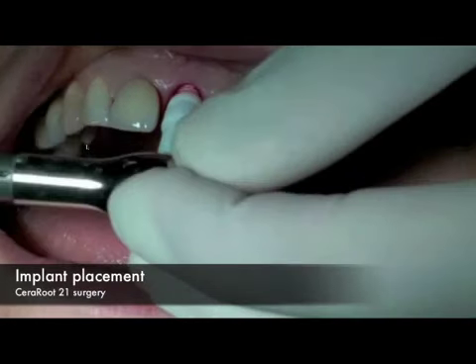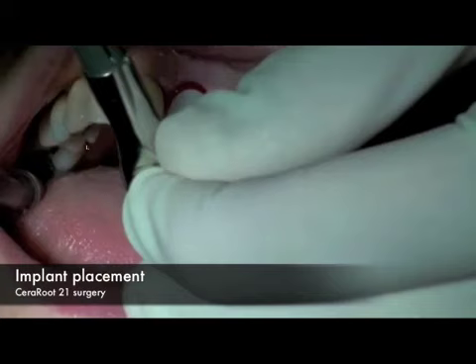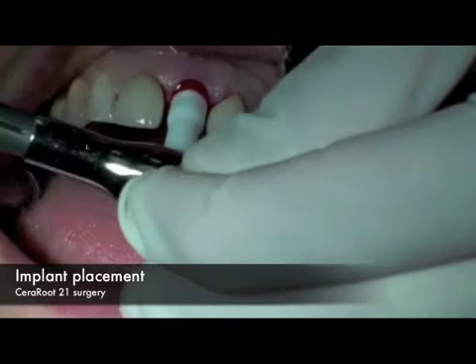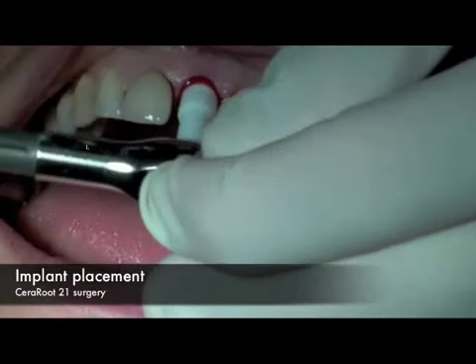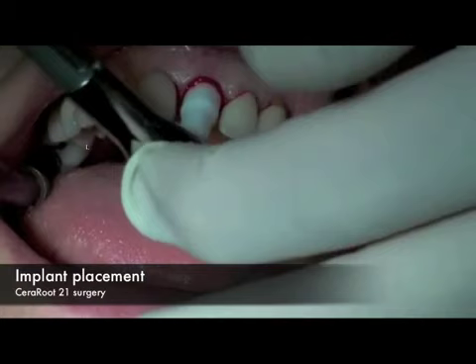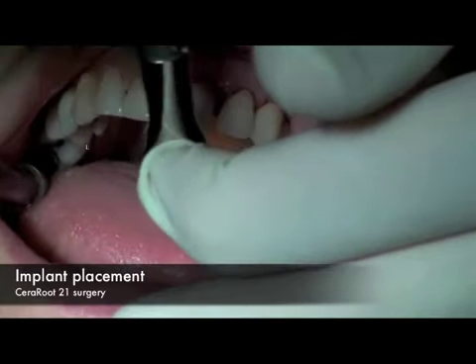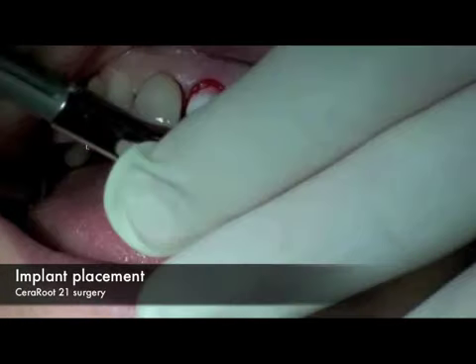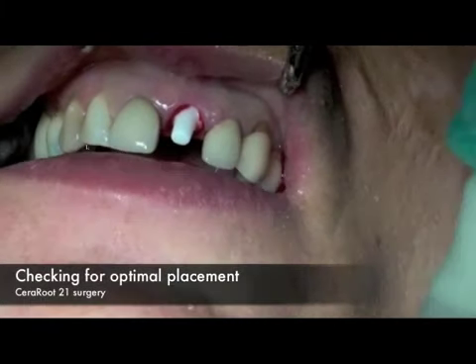And at this stage, we're advancing the implant. We want the restorative margin to be at the gingival level or slightly subgingival in these anterior cases. You're thinking about this just like where you would want to put the crown margins. You're not thinking about putting it against the bone, because the whole surface of the implant is going to integrate. We just want to know that our restorative margins are where they need to be.